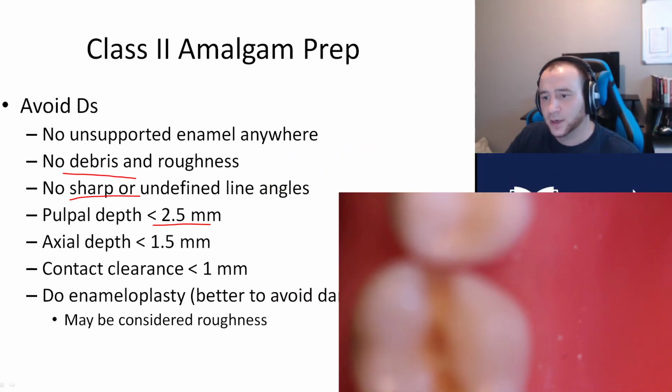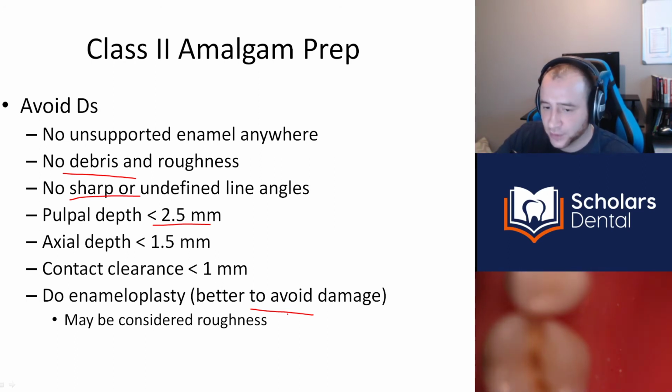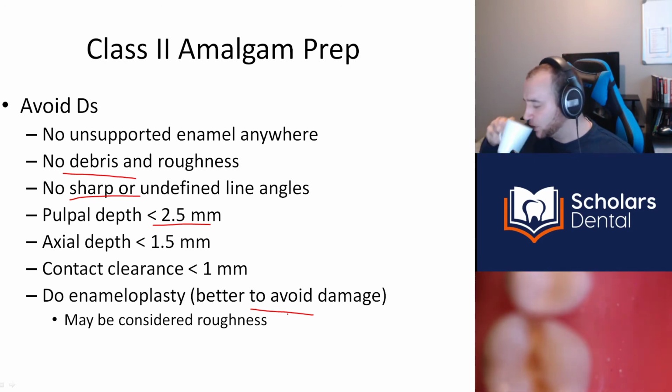Okay, let's take this back down here. Then you have to do enameloplasty. So better to avoid damage, obviously, but learn how to do enameloplasty. If you're taking a course, ask some people that are also with you in your ACS, and we might also do a video about it if that's something that interests you.